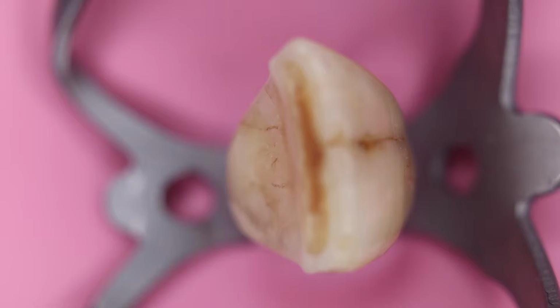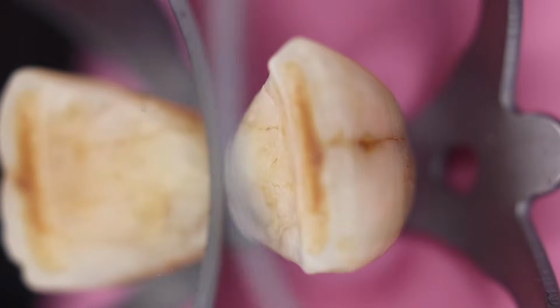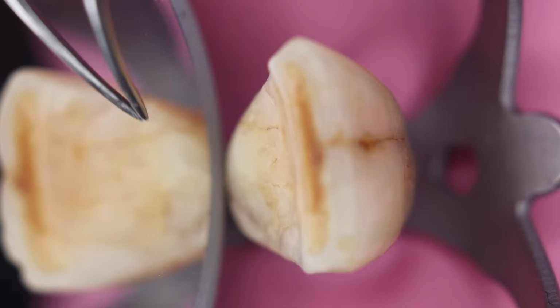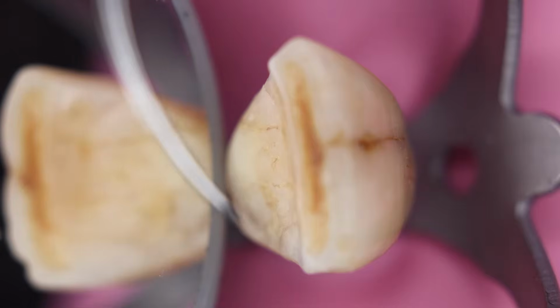So first of all, whenever we are doing the maxillary central incisor, we should evaluate whether the tooth is strong enough, that there are no visible fractures or fragment that is mobile over there. So these things should be considered.